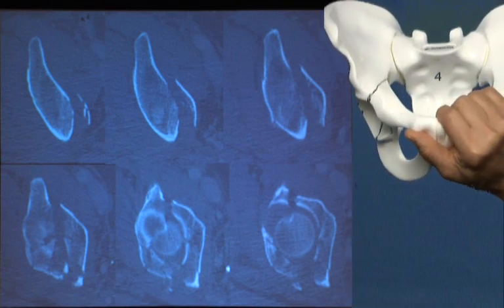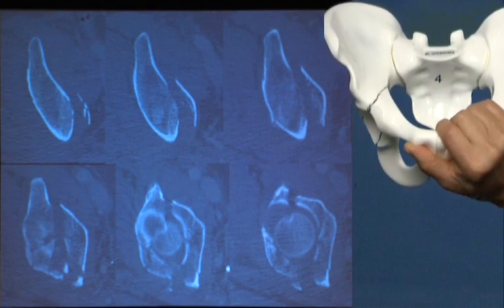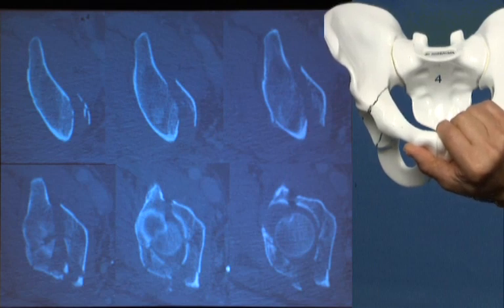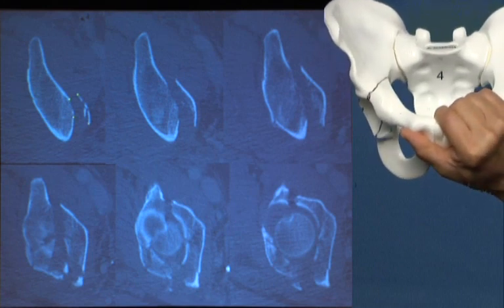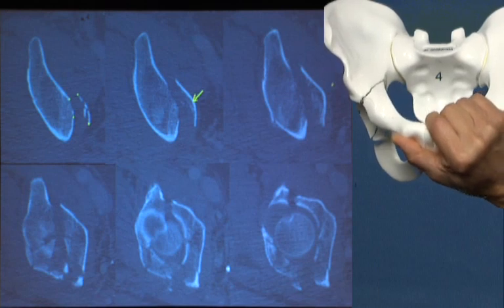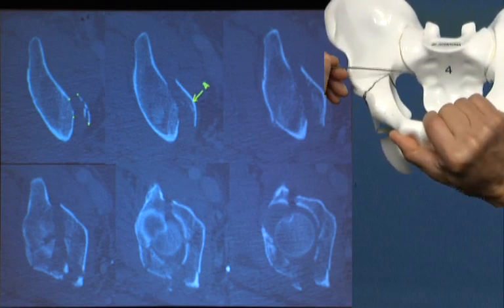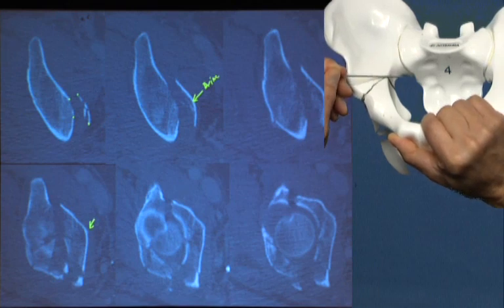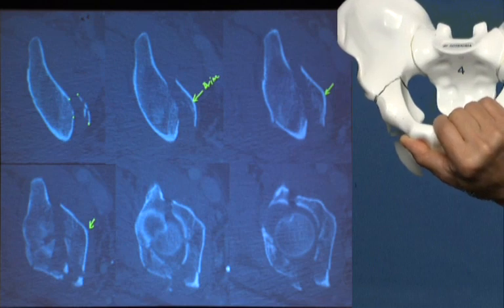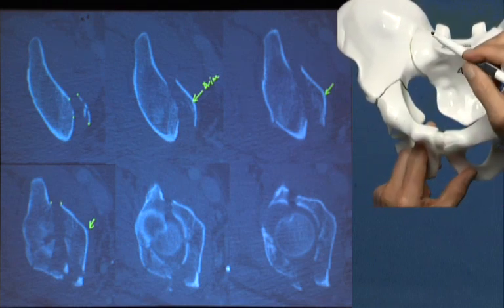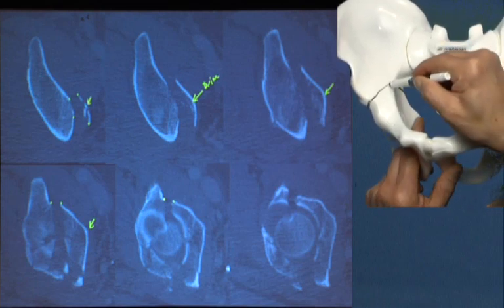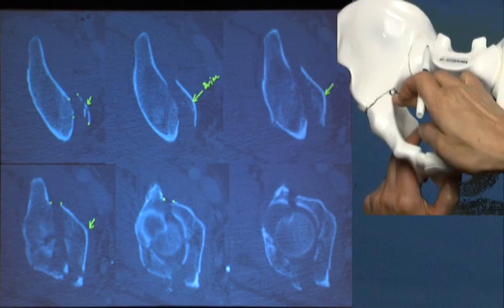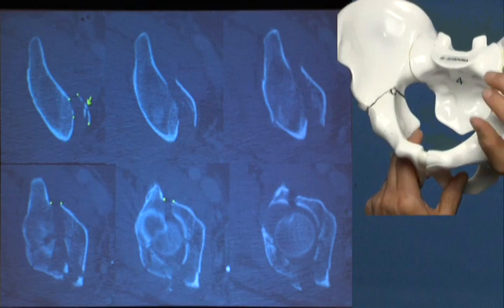We'll go to the upper cuts of the CT scan. On the most cranial cut, what we're looking at is a displacement at the pelvic brim. Therefore, going back to my bone, the most cranial aspect of my fracture is occurring at the pelvic brim — and that's confirmed. As I follow the CT scan cuts down, I verify that was correct, but I see some additional fragmentation just at the very top, which is actually pretty common when a fracture line crosses the pelvic brim. I'll go ahead and draw a little bit of pelvic brim comminution where it turns the corner and crosses.